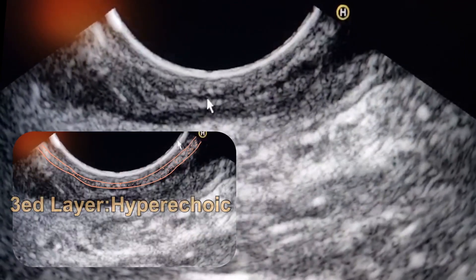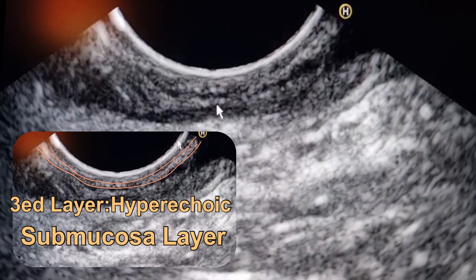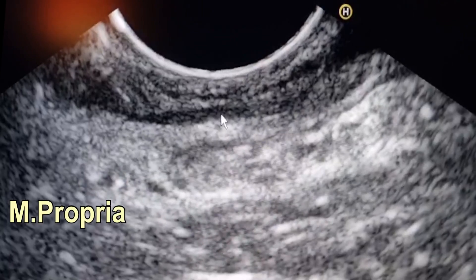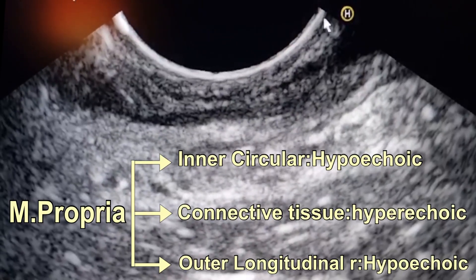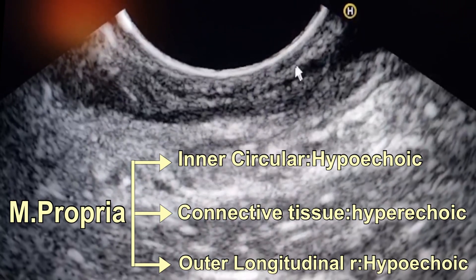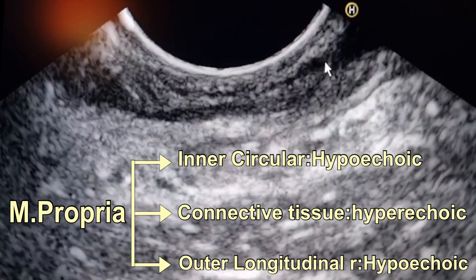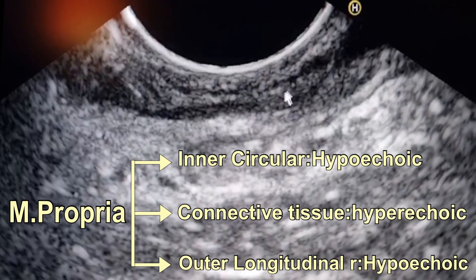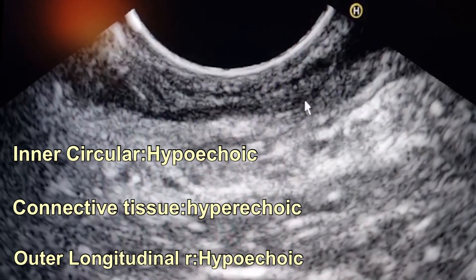This is the circular muscle, connective tissue band, and the longitudinal muscle layer of the muscularis propria. So here: this is the mucosa, muscularis mucosa, submucosa, circular muscle layer of the muscularis propria, connective tissue band, and longitudinal muscle.